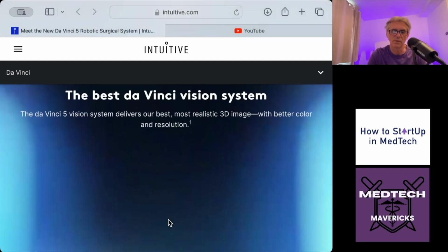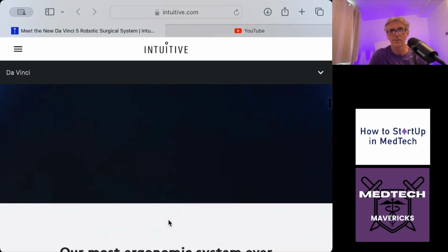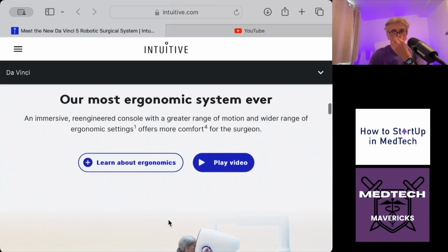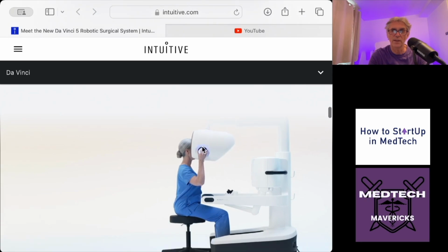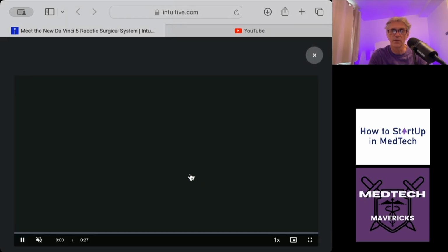But what it was talking about was the fact that you've got much higher pixels in there in the screen, in the twin eye streams. It gives better 3D depth perception. There's better black contrast. There's better colors. There's better luminosity. And I can tell you, I've been on the Xi many times, and I went on the DV5. It's a massive upgrade within that screen, and I think it will help a lot because it's going to catch up with some of the 4K screens that the open consoles are putting onto their systems. So, yeah, pretty impressive. I don't know why the website has been screwing with me. So, yes, ergonomics is another big one on this. I did talk about this a lot, and I am very impressed with the way that this thing works. Let's have a little play of the video for you there.